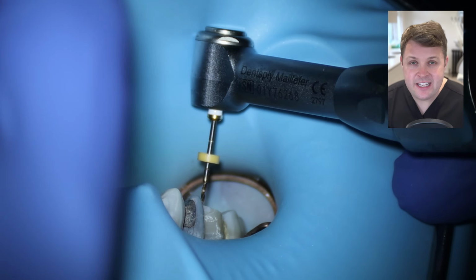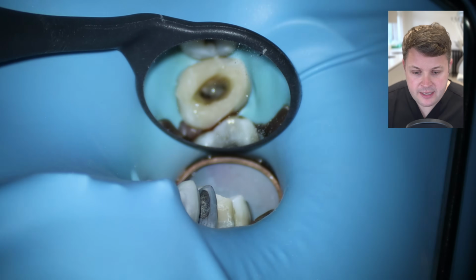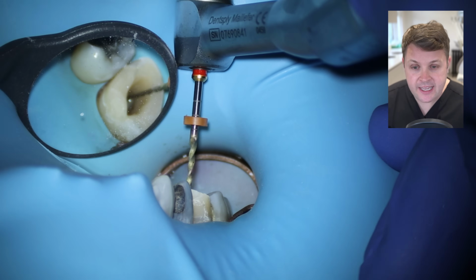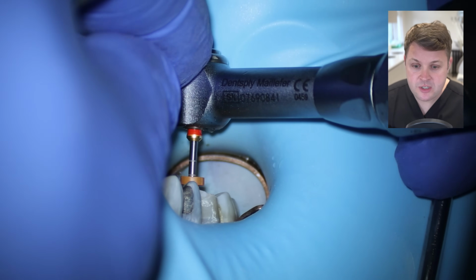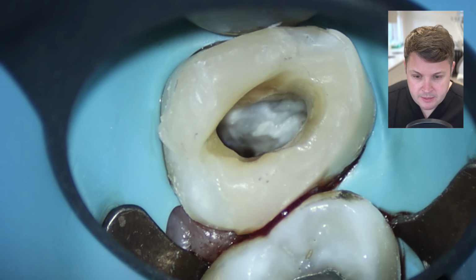And you know, despite initially having difficulty with the MB, I feel like the hand file the second time I try to get to length goes to length quite nice and easy. So again, like the palatal, I'm going to go from a size 15 straight up to a size 25. And of course, if I'm using a size 25 and it is getting a bit of resistance, I can always drop it down to a 20.